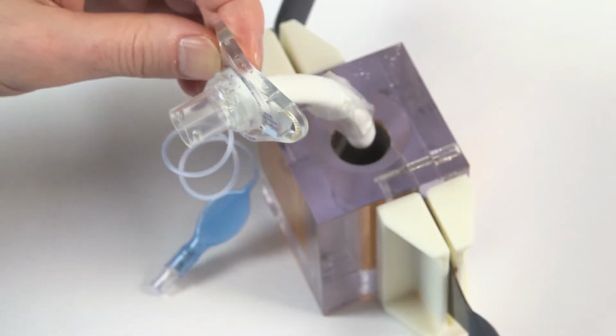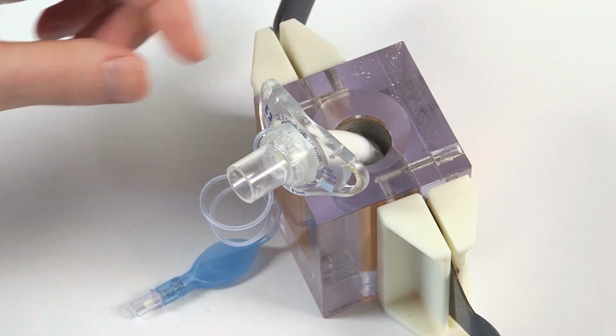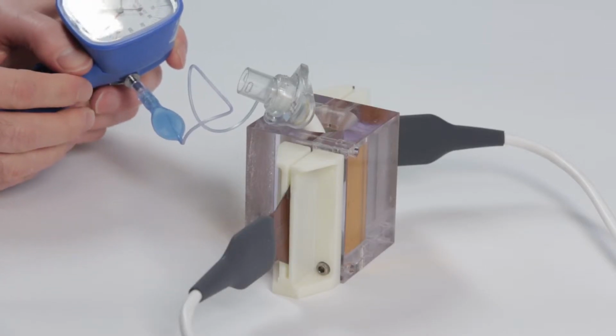We evaluated 3 different sizes of product, a small, medium and a large. We placed those products into a model trachea. Within the wall of the model trachea, we had a 2-dimensional pressure array, and that pressure array contained individual elements that could sense the contact pressure between the cuff and the wall of the model trachea. Those individual elements created an electrical response relative to the force that was applied by the cuff in making contact with the wall of the model trachea.